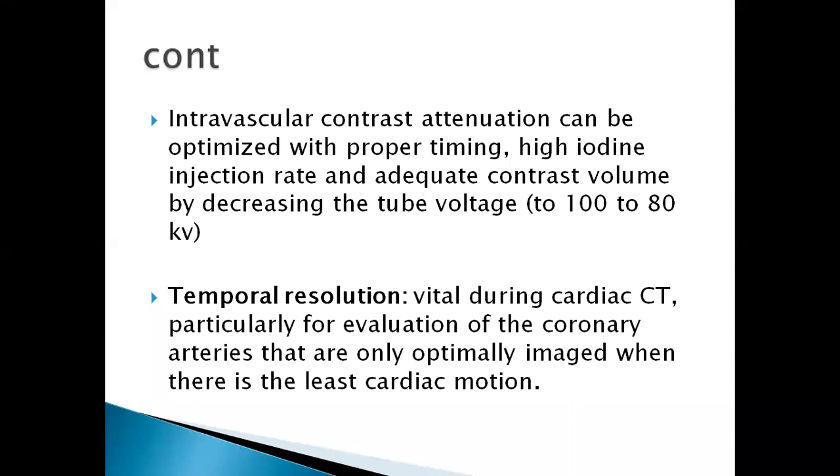But even with administering contrast, there are certain factors that you can still put in to make sure that you get a better image. So you need proper timing. Also, the injection rate is a big factor, and the volume of contrast that you inject in the patient, as well as the tube voltage itself.